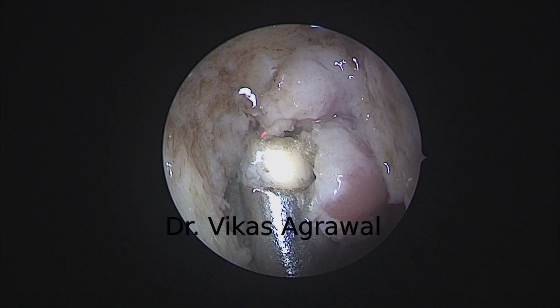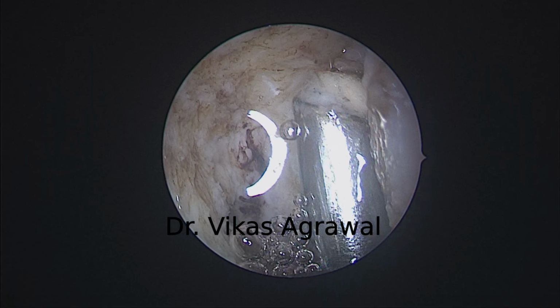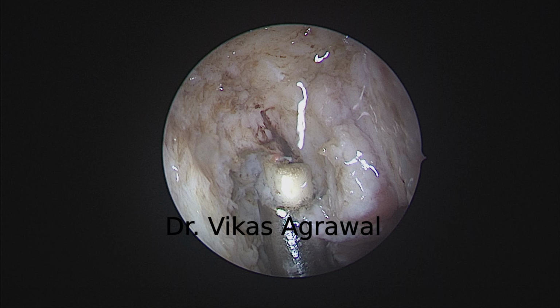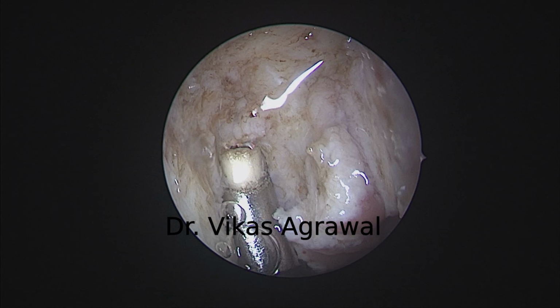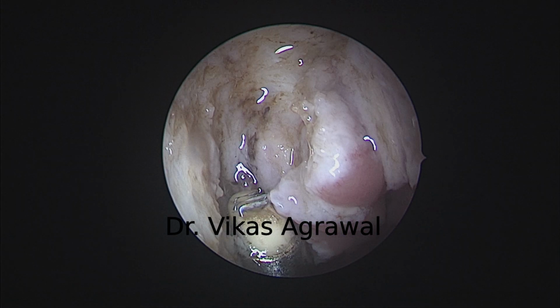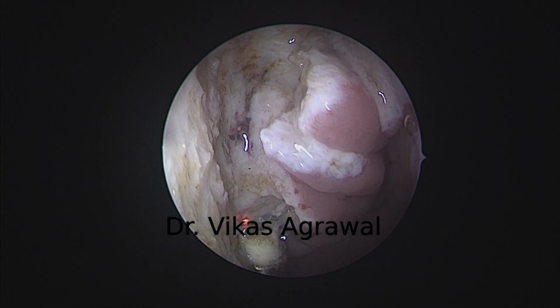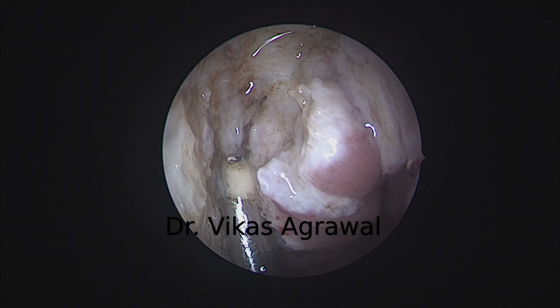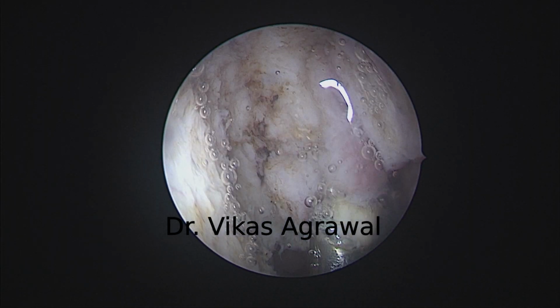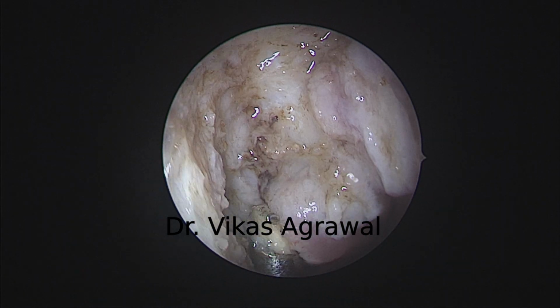That when you do a blind curette adenoidectomy, you leave a lot of tissues here and there. Now you can always argue that it's not malignancy, so how does it matter whether you leave or not? Then you have subjected the patient to anesthesia. You are doing a surgical procedure. Why not do it completely? And why not do it cleanly? So that's the buccopharyngeal fascia, which is the posterior boundary.